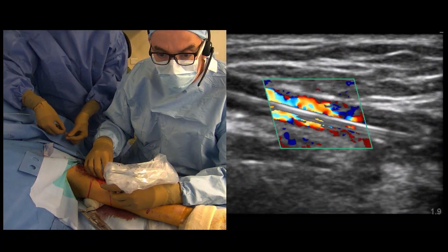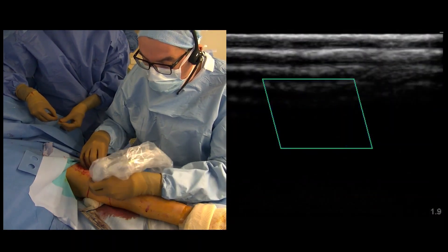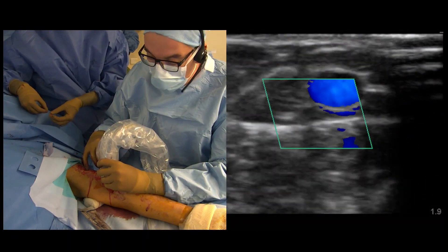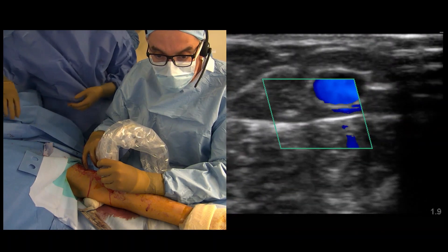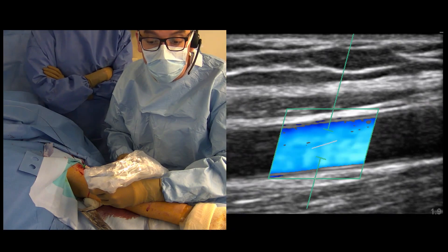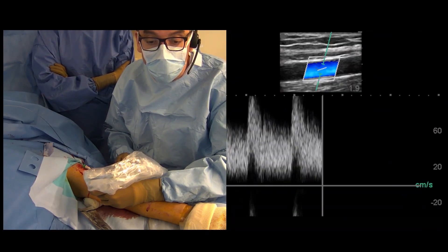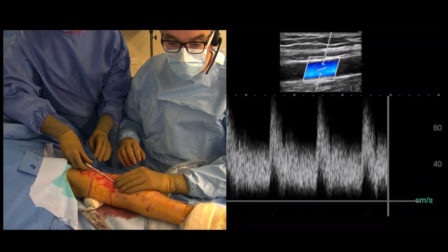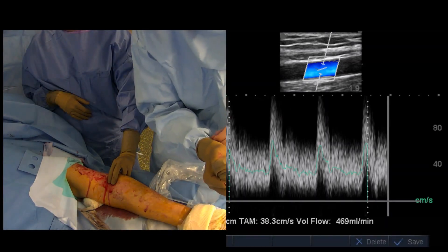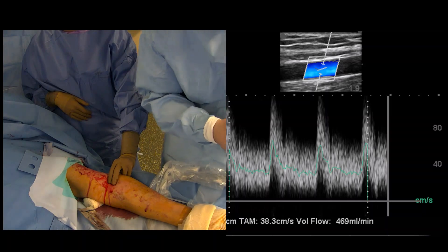You can appreciate there is definitely great fistula flow — no doubt. Putting the probe on the cephalic vein, you can see great systolic/diastolic flow even though I have my sheath in and there may be some spasm. On Doppler, I have a great thrill and a great feeling. Measuring the flow now: we have 469 mL/min of flow right at this point, and the procedure is done.